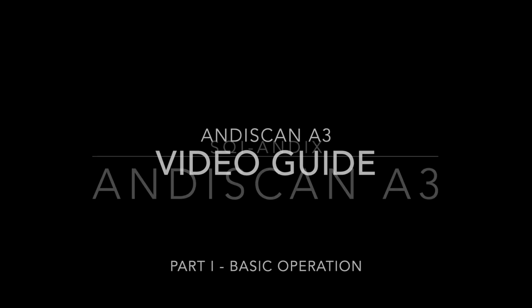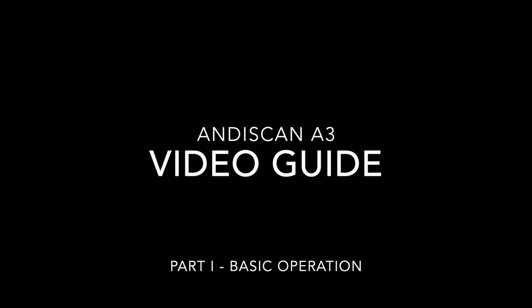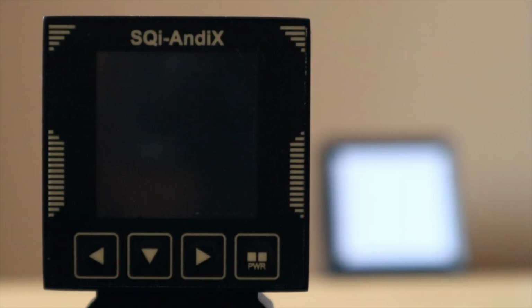AndiScan A3 Video Guide, Part 1: Basic Operation. Section 1: Switching the device on and off.